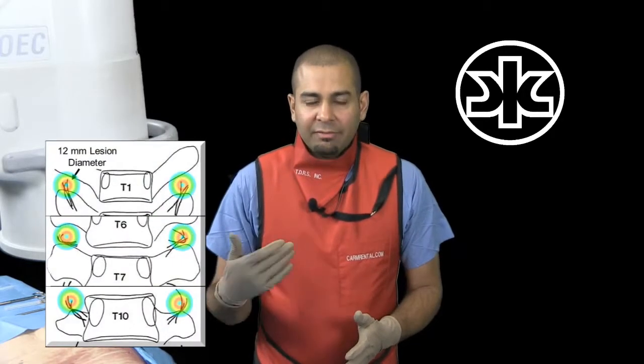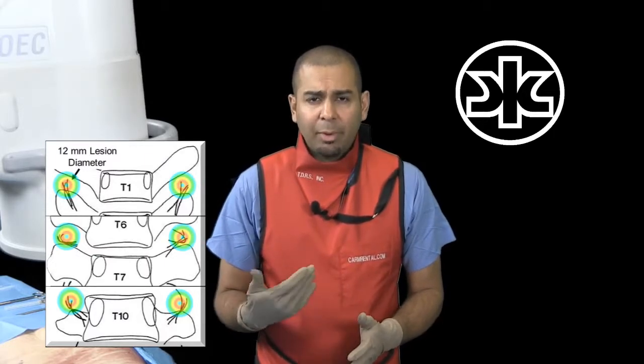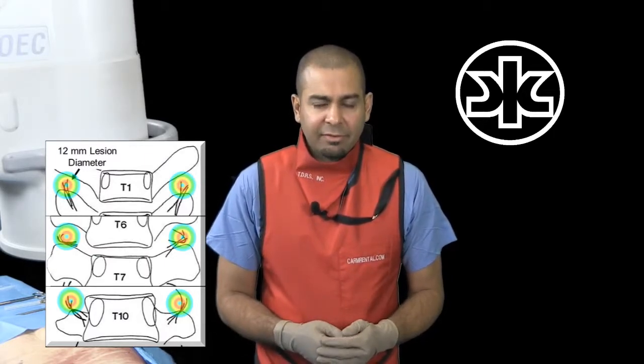Some of the interesting things about the thoracic spine are that there's variability of the medial branches. And one of the advantages of this procedure is that it accounts for that variability by giving you a bony backstop, increasing safety for the procedure. The other advantage of the procedure is that the distal projection of the lesion allows you to capture the medial branch without having to alter your trajectory or position significantly.